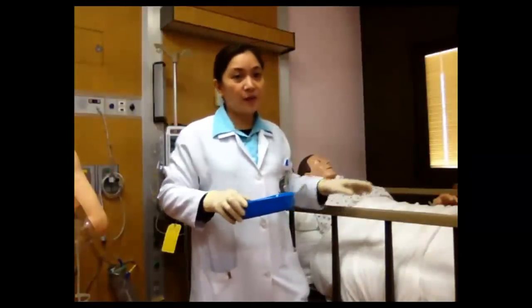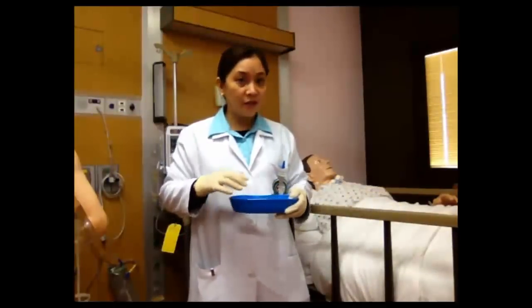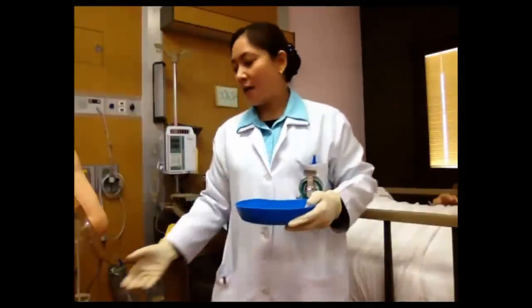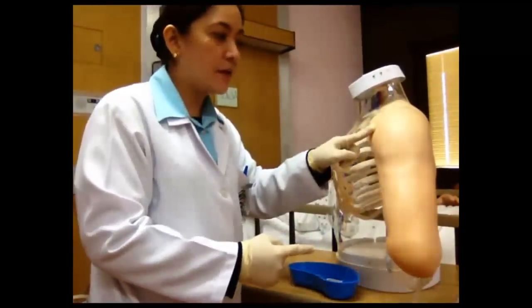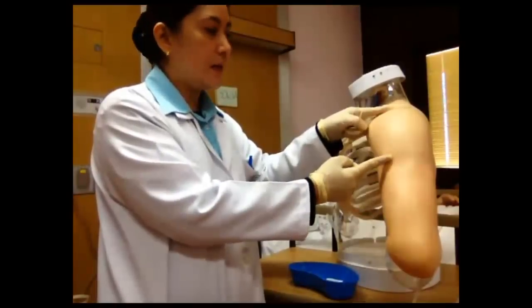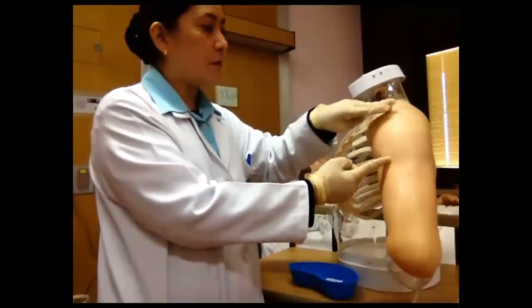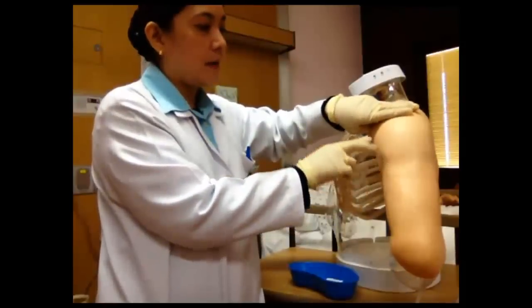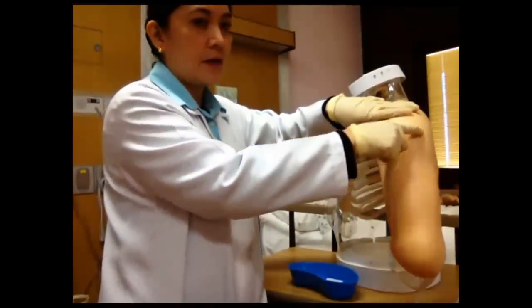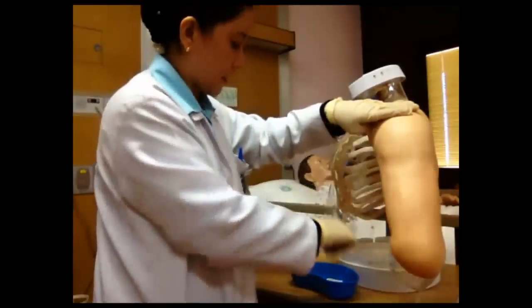To have a better instruction and a better look at how I'm going to do the injection and the correct technique of it, I'm going to do it on our simulator arm. Now I'm going to give an intramuscular injection to the deltoid muscle. How to locate the deltoid muscle? Just place your 3 fingers below the acromion process, and here, this is the site of injection. This is the deltoid muscle, and this is the site of injection.